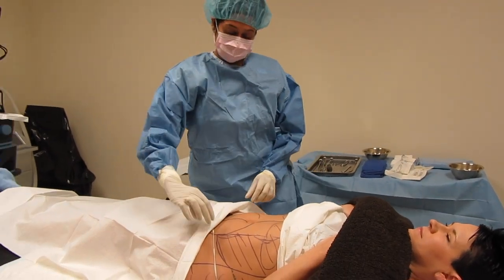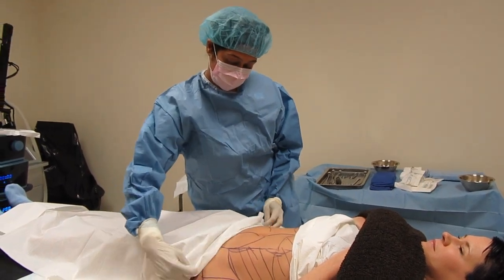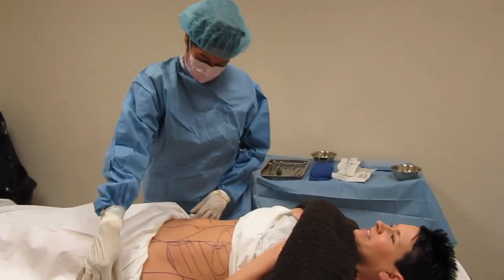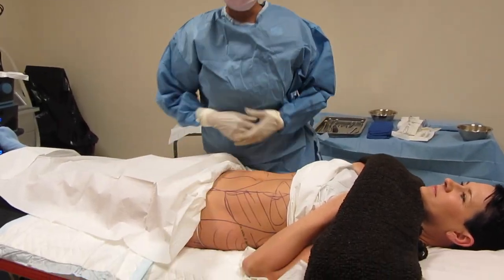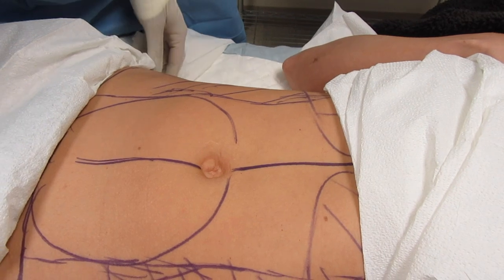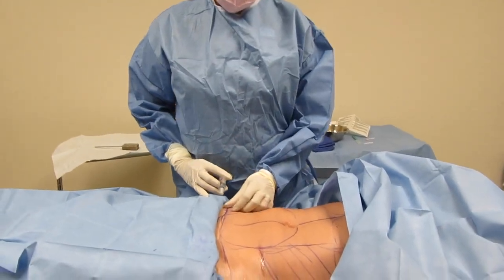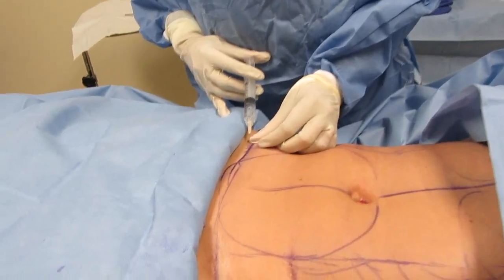Hello, today we are going to be doing a Vaser liposuction and this is Nikki. Hi Nikki. Hi. And we're doing Nikki's abdomen, her belly and her sides. And if you want to take a look, this is how I marked her. I'm sorry I didn't take any videos while we were marking. Incisions to do this procedure, and I'm going to numb those spots.